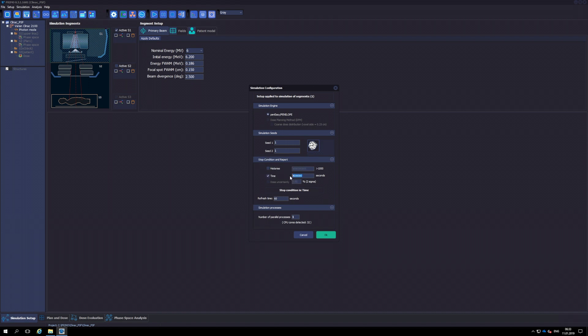Usual simulation times for Segment 1 are of the order of hours or days, depending on the statistical uncertainty desired when subsequently computing the dose. However, once the initial beam parameters that reproduce our Linac have been determined, only one long simulation of Segment 1 for tallying a sufficiently rich phase space file is required. In other words, Segment 1 is simulated once and for all.